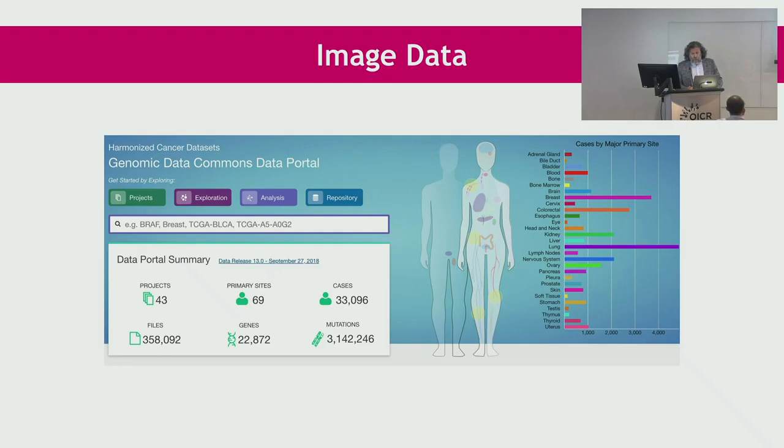But among others, the NCI, National Cancer Institute, the TCGA program, you have a large number of glass slides, digitized, with confirmed diagnosis, with pathology reports, with genetic information, if you like. So you can work with that. So there's a mixture of data. That's maybe the worst thing about it, or actually a good thing about it, that it's heterogeneous. It comes from different manufacturers, it's not from one scanner, so that makes it good to really work with. So this is one source of data that we are using.